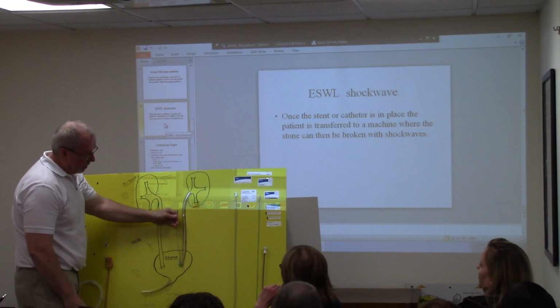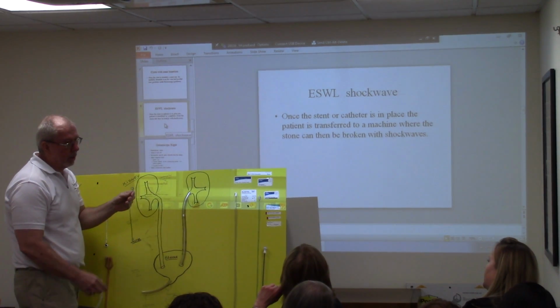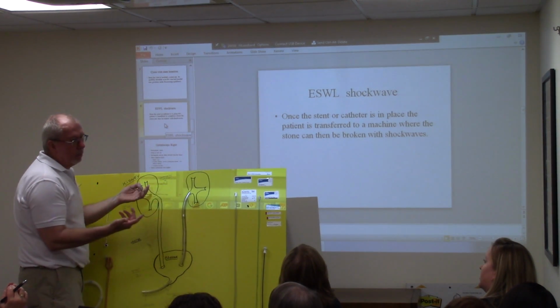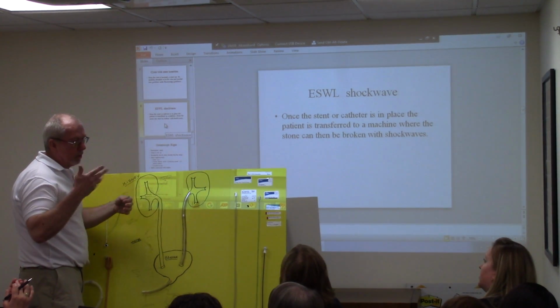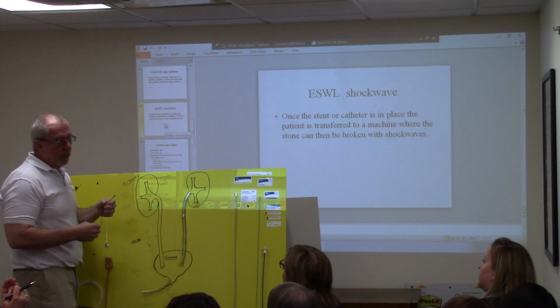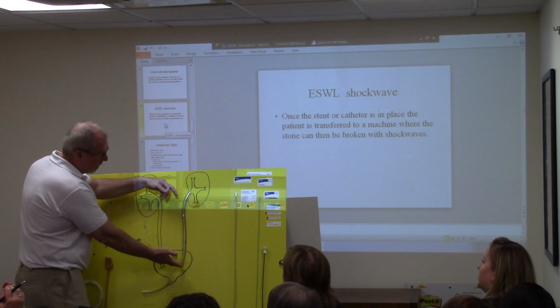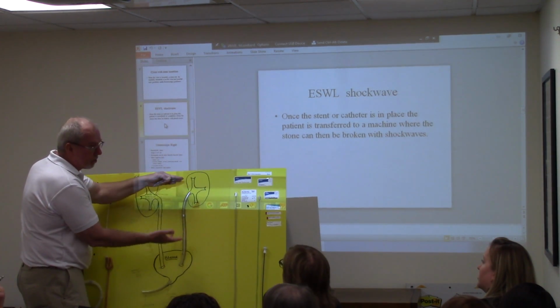I know you said you had different sizes. How do they determine what size a patient needs? Do you just go in with one and see? Well, from the x-ray, you can estimate. Some people will ask you how tall you are. Okay. But I don't find that a very accurate way to do it. You have to look at the x-ray and then kind of measure out.